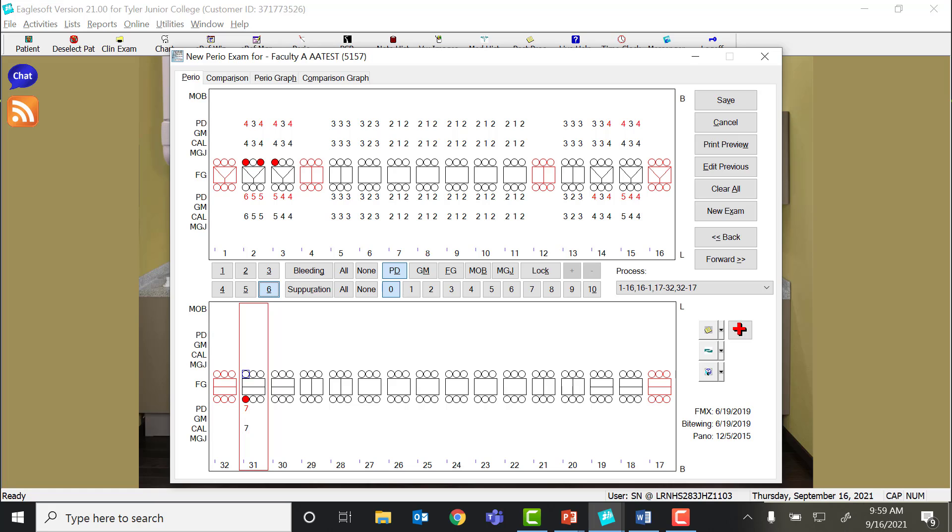If someone else is typing this in for you, it would be efficient to say G6, G7, G whatever, to get the bleeding spots in there as you go. That's just a shortcut, or you can click the actual bleeding button.